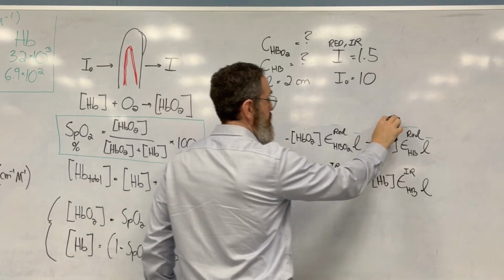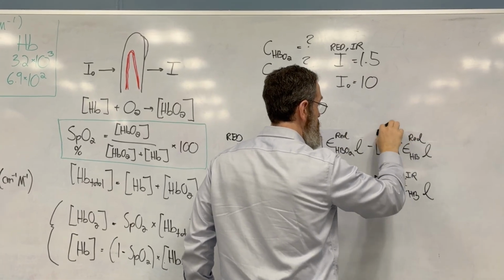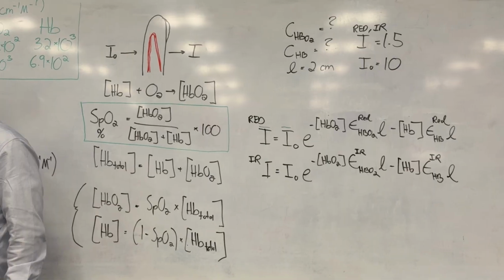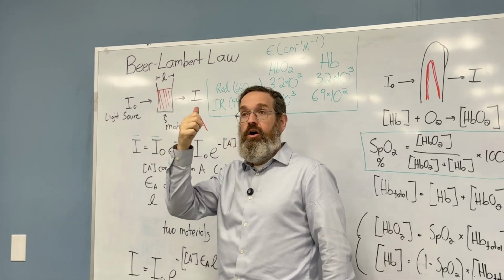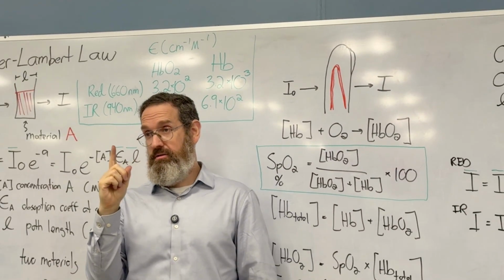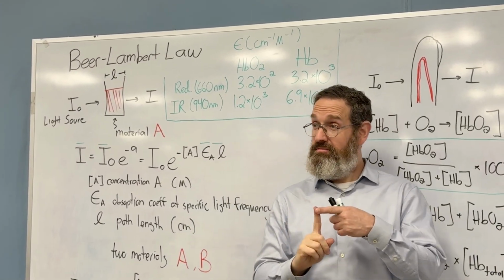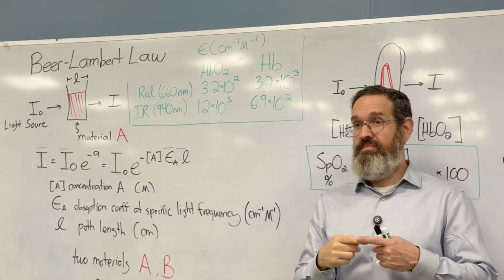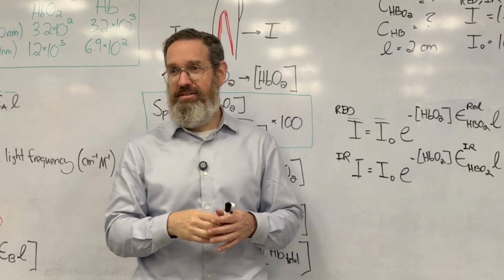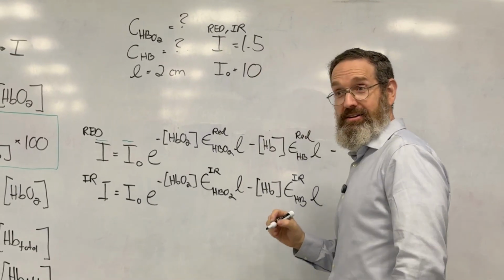And that problem is that in this vial there were just two things. I said there's only two things in the vial, oxyhemoglobin and deoxyhemoglobin. But in my finger, there's more than two things. I have skin, and I have fingernail, and I have bone, and I have fat. Hold on a second.